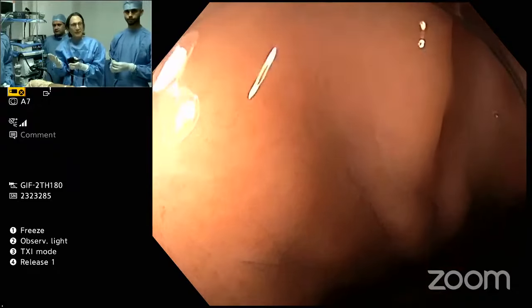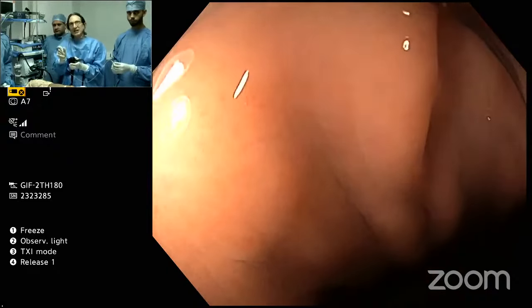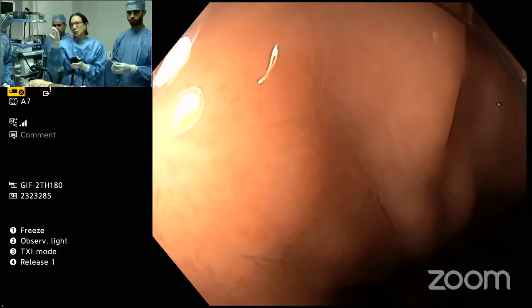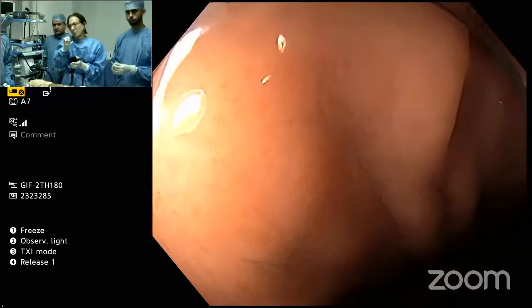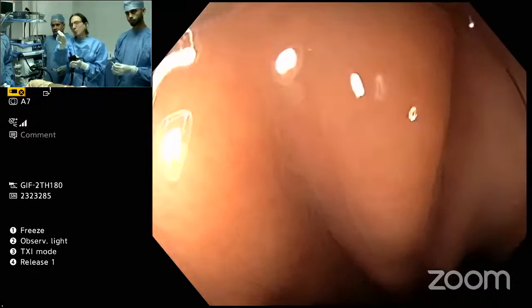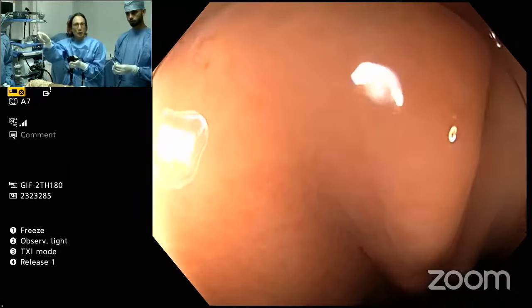And then there's the DAT clip, dual action tissue clip from Microtech, which I use routinely in my practice in San Francisco. This is an amazing clip because what it does is it allows you to independently grab each of the margins. So it's like the twin grasper. So there's a post in the middle, and you open up the prong on one side, grab the edge, and then you close that, right?